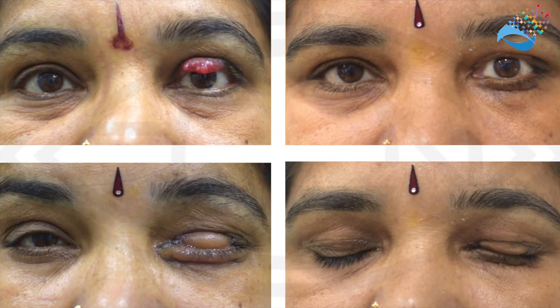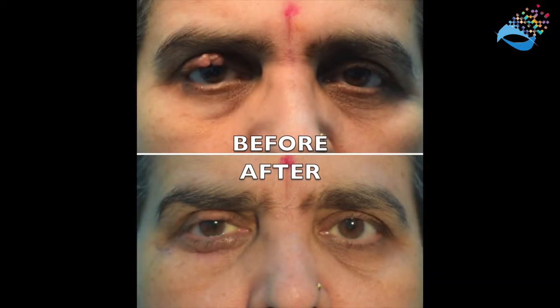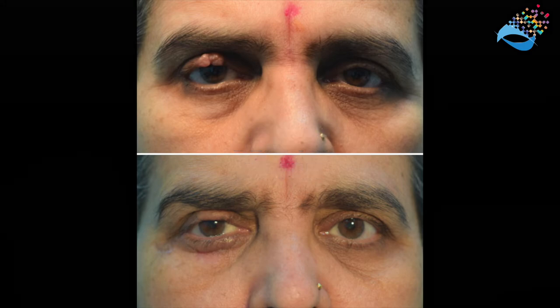Therefore, the Cutler-Beard procedure is an effective, simple, and reproducible technique to address upper eyelid tissue loss.